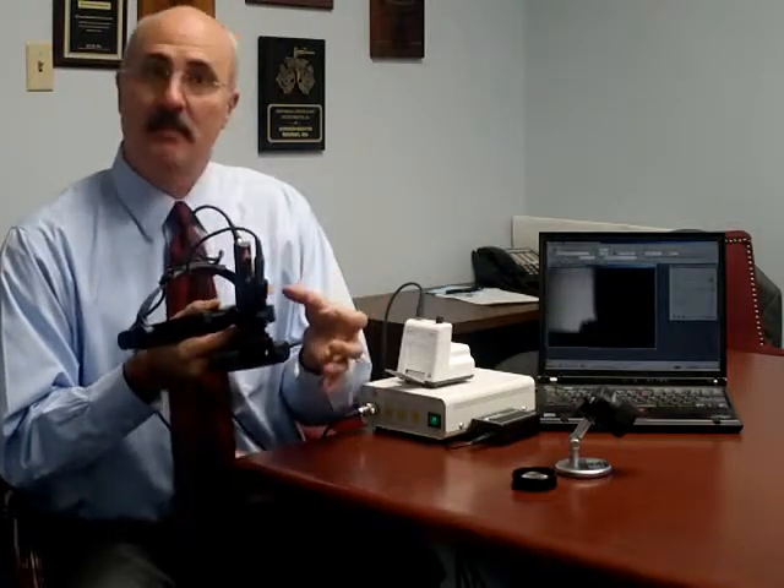The Heine Video Omega 2C is built from the ground up as a video unit. Rather than attaching a video camera to an existing indirect ophthalmoscope using a beam splitter, Heine has chosen instead to build the video camera into the instrument head itself.